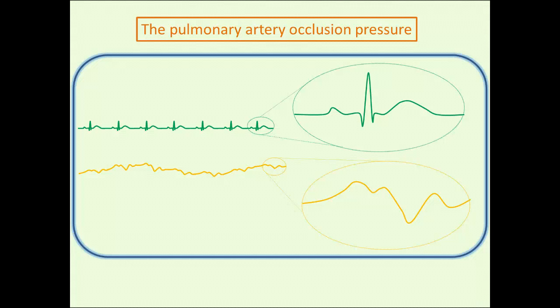And again, if you aren't seeing adequate A and V waves, this could be a marker that you are measuring alveolar pressure and you are in zone 1 or zone 2 physiology. And there are actually well-documented cases of patients who have a dampened, flattened wedge pressure because the pulmonary artery catheter is lodged in zone 2 physiology, and the patient receives some blood or some crystalloid and re-expands their vascular space, and then physiologically shifts the pulmonary artery catheter from zone 2 to zone 3 physiology, and then the A and the V waves come up beautifully.